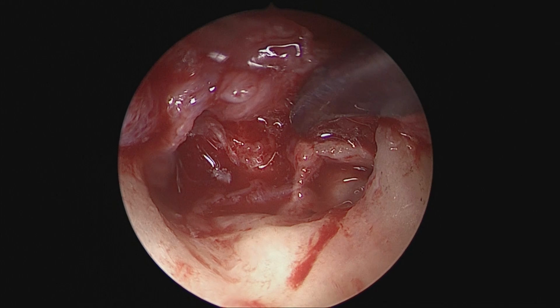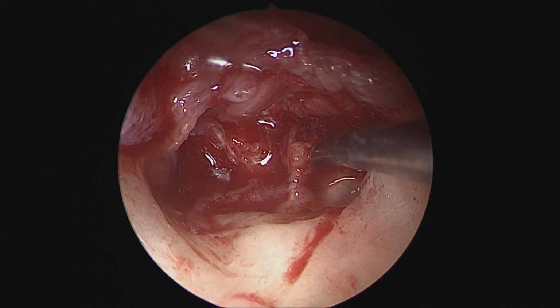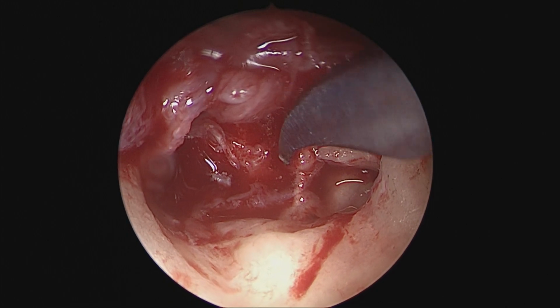Also, we want to be very sure that the medial attic is free of disease and does not harbor any kind of grossly diseased mucosa or squamous epithelium.